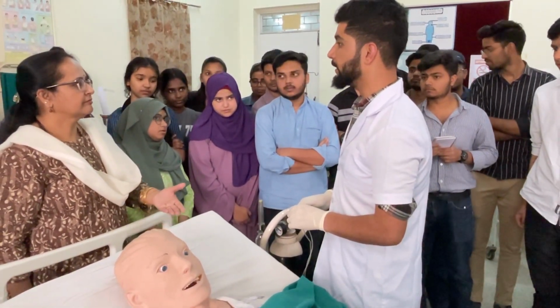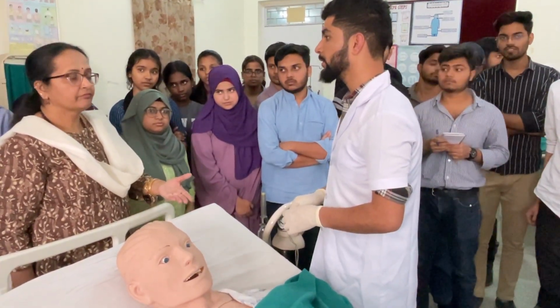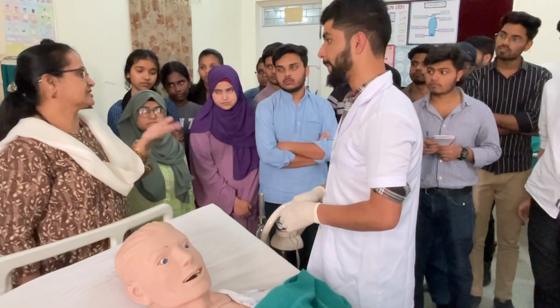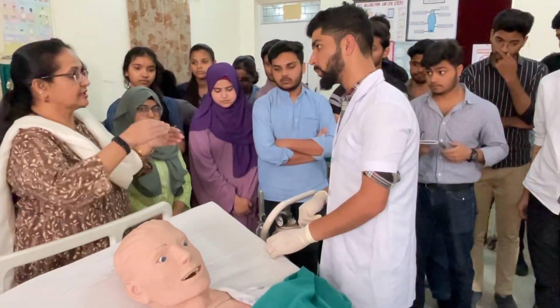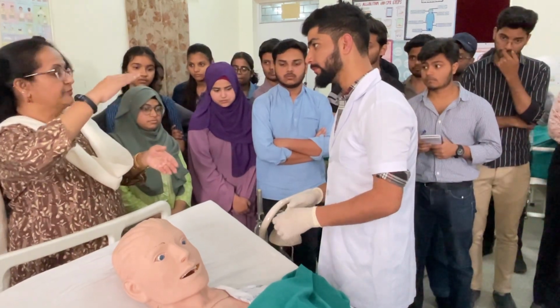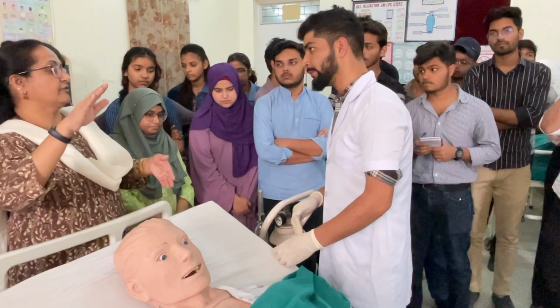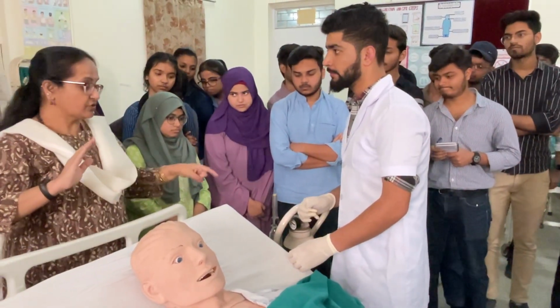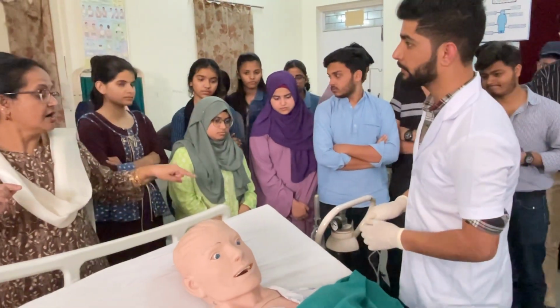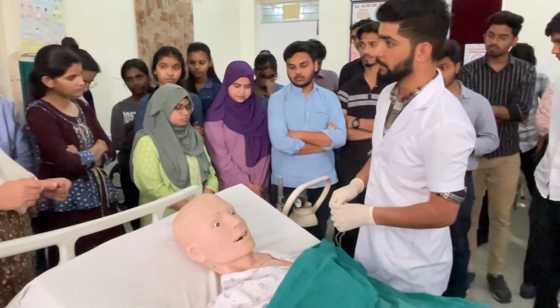In order to prevent dryness of secretions. To moisten the oxygen, because oxygen is inhaled through the tube, so it has to pass through this water. When it passes through the water, it will humidify the oxygen also. Clear? So daily you have to empty this bottle and change the water.